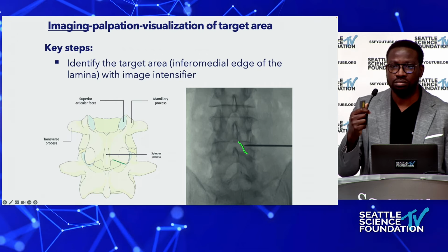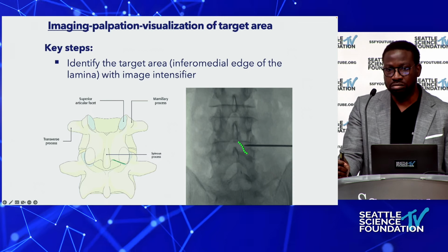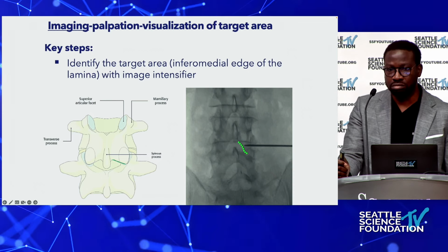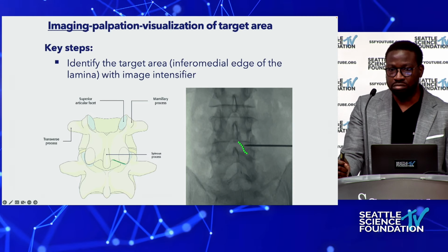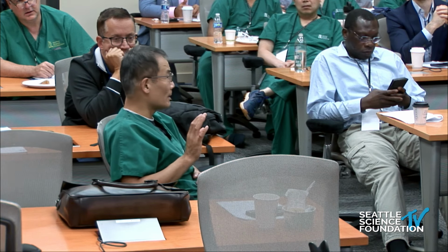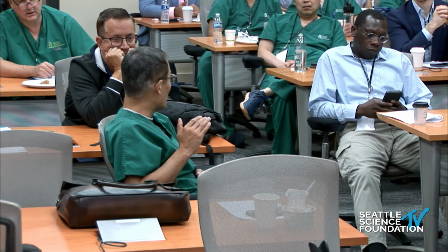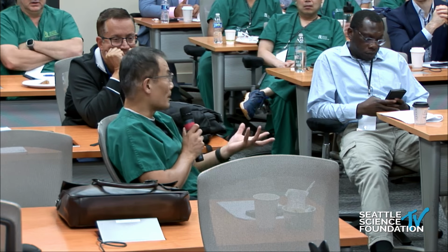Right, for scoliosis with the concavity or fractional curve, if the foramen is very, very tight, I usually do not use a reamer. I use the endoscope. I do my foraminotomy with a high-speed drill, so everything is under direct visualization. You usually start more dorsal, so that way you guarantee you're going layer by layer and make sure it's safe. So that's just for extreme cases, like concavity or fractional curve.